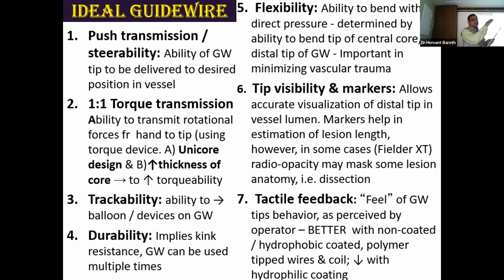If it goes through simply, you feel that it is sliding through. That feeling of the tip is called tactile feedback. Some wires, particularly non-coated wires, have the best tactile feel. But if you coat it with a hydrophobic coat, then tactile feel comes down. If you make it hydrophilic, then tactile feel goes down even more.